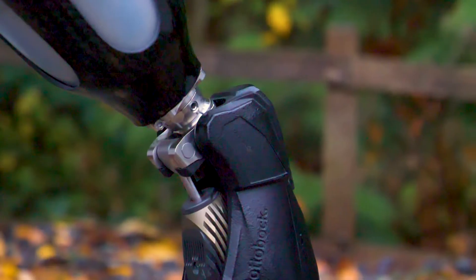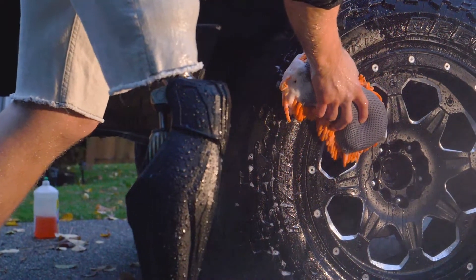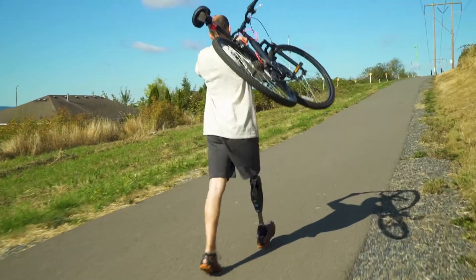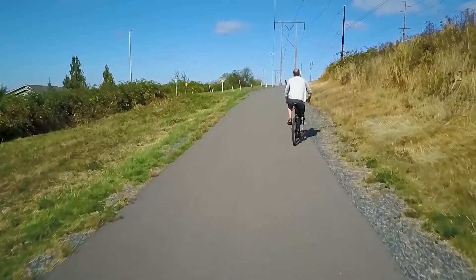Having a knee that's 100% waterproof, I don't have to worry about keeping the knee dry. The X3 just keeps me extremely active. I couldn't do this with any other knee. I rely on this to go running with my son — we go hiking all the time.